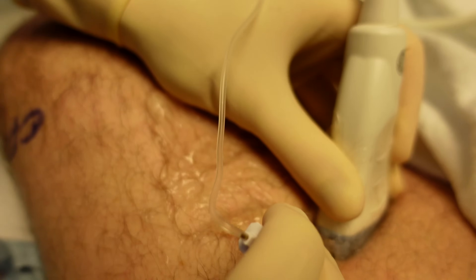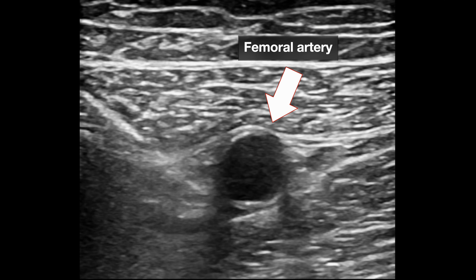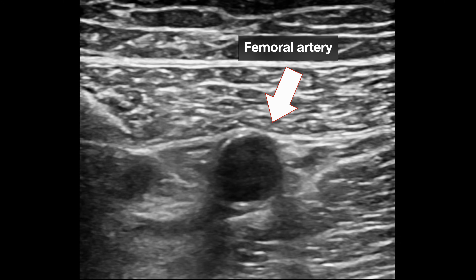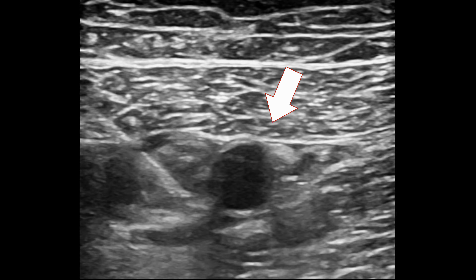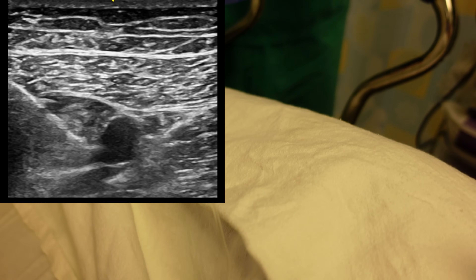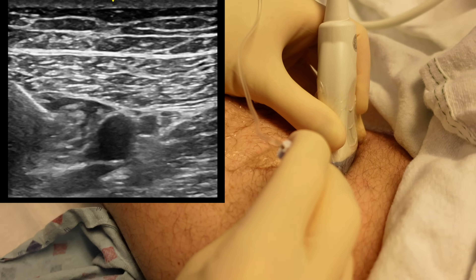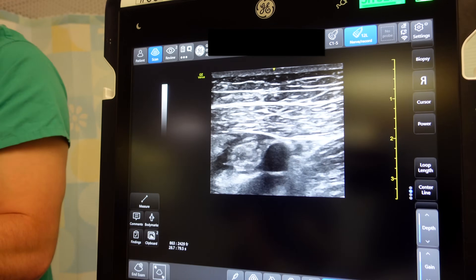I'm just going to start injecting slowly, and you can see the artery getting pushed away from the pressure of the injection of the liquid that's getting introduced into that space. We keep on aspirating just to make sure we didn't move into the vessel. I think we are all finished. Excellent — and you can see the needle coming out on the screen. And that's it, all done.